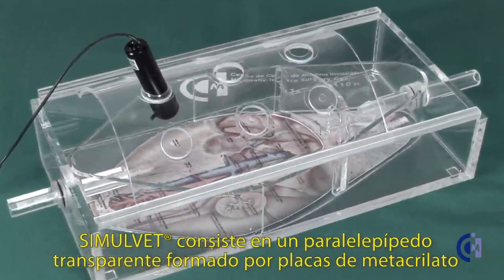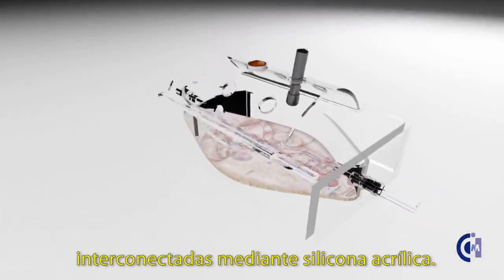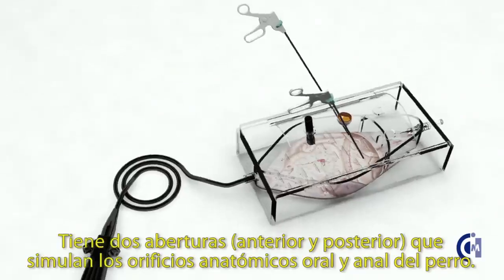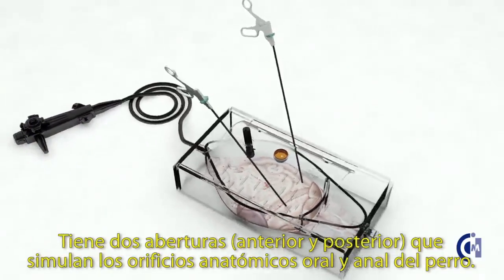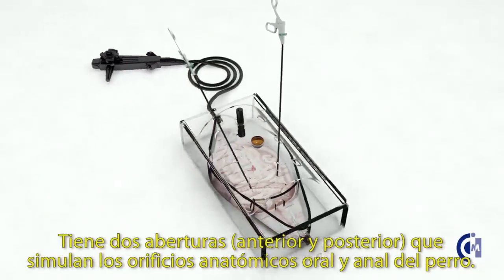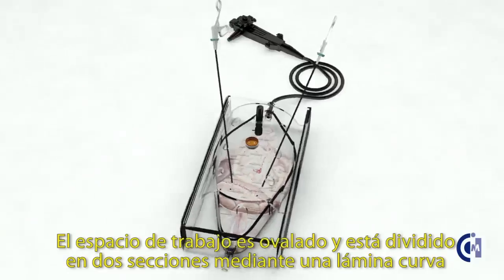SimulVet consists of a transparent parallelepiped formed by methacrylate plates interconnected by acrylic silicone. It has two holes, front and rear, which simulate the anatomical oral and anal orifices of the dog. The workspace is oval-shaped and divided into two sections.